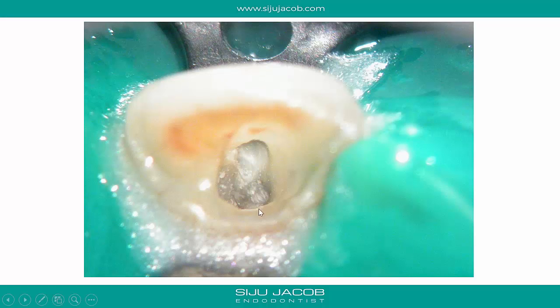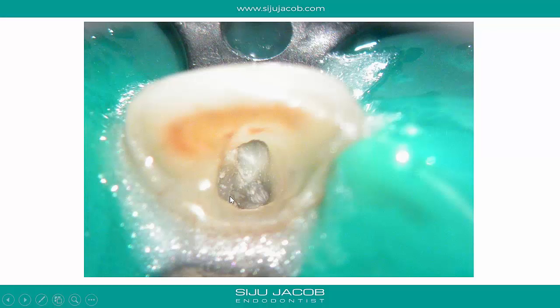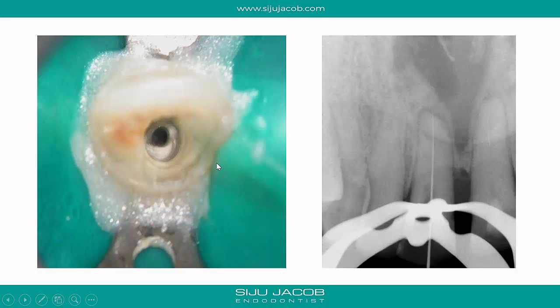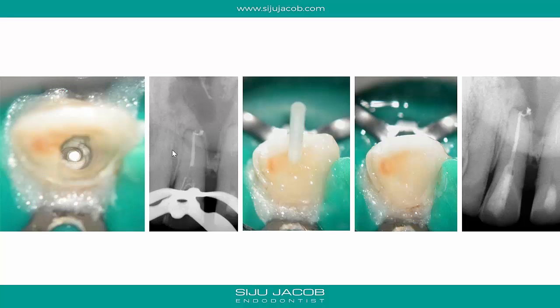When I removed the temporary filling, I saw a very large access cavity. Because of the information from the CBCT, I knew I didn't have to look for the canal in the labial part of the access cavity — if there was a canal, it was going to be in the palatal part. That's exactly where we looked, and that's exactly where we found the canal. Once you find the canal, the rest of the procedure is fairly straightforward: we clean, shape, and obturate the case. That's case number one.